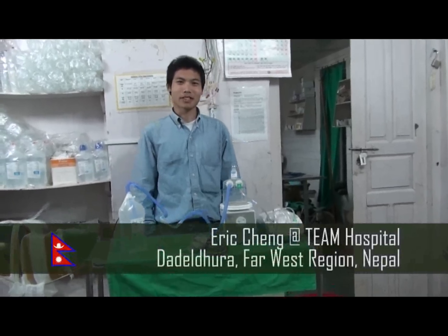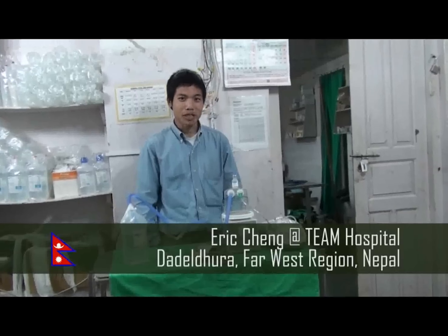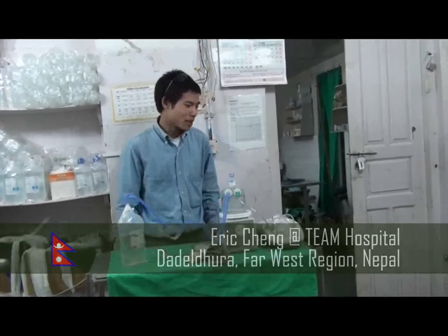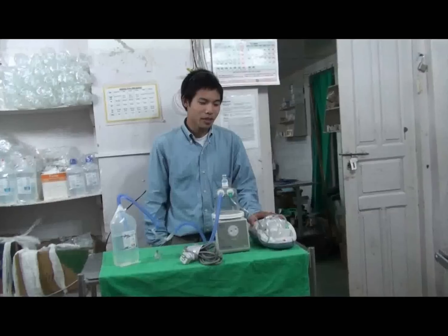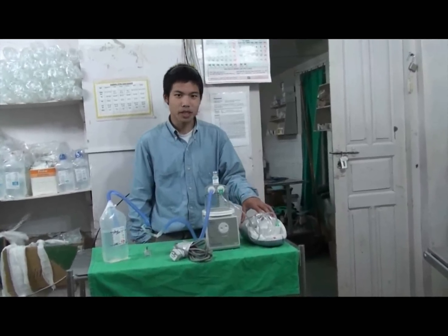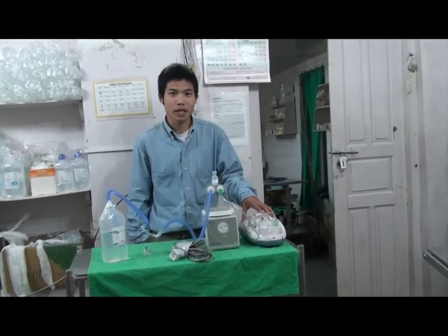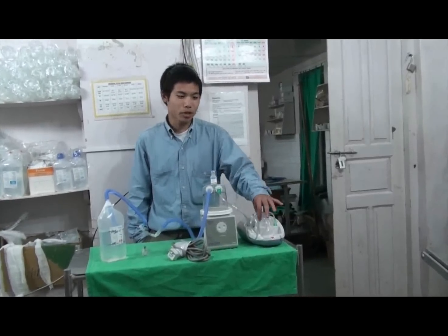Welcome to Team Hospital in Dadeldhura, Far West Region, Nepal. Here we are demonstrating a bubble CPAP system that we've set up here. We're using a nebulizer because oxygen is very hard to get to in this place, and also it reduces the risk of ROP in the premature babies.